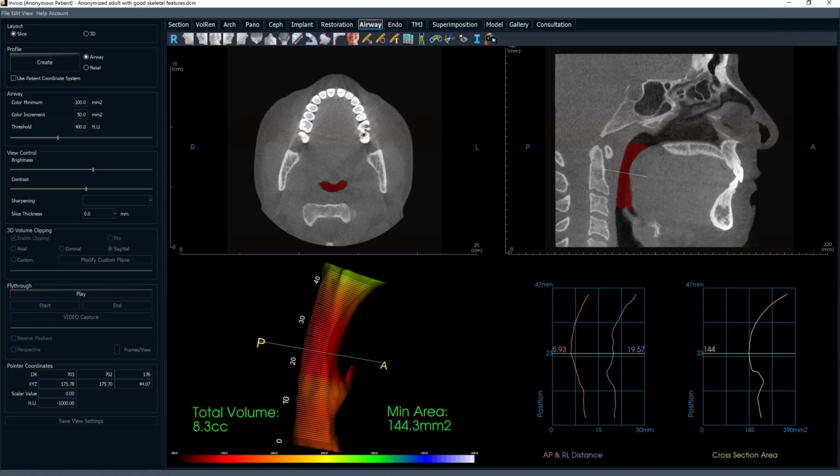So it looks like it says here, you mentioned making a note of stylo, sorry, I might mispronounce this word. That's fine. It's hard for me too. Stylohyoid ligament ossification. Would you add it to your report even if there are no clinical symptoms? Thank you very much. Yes, I do.